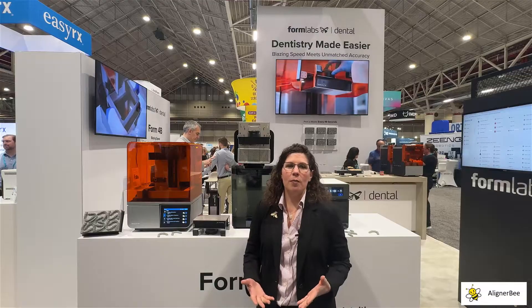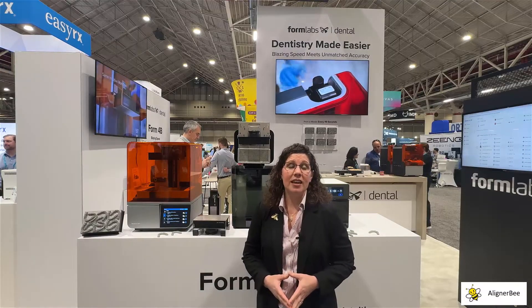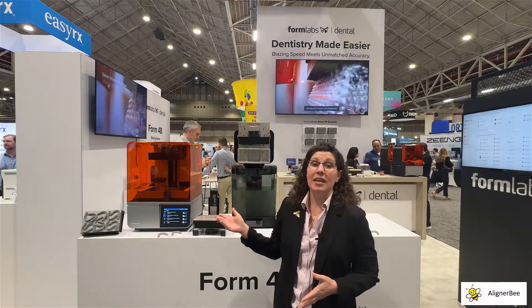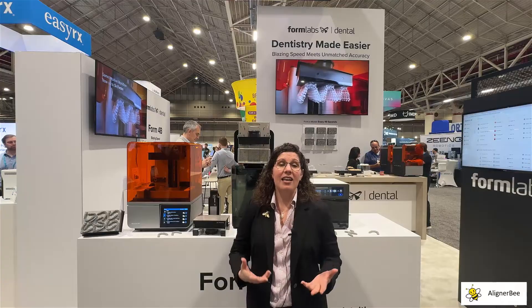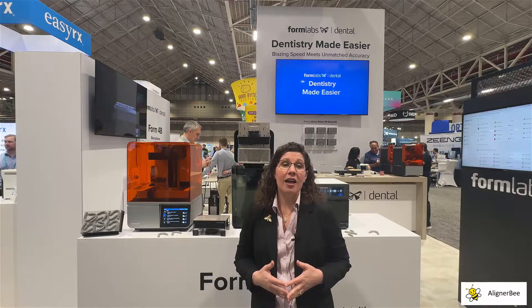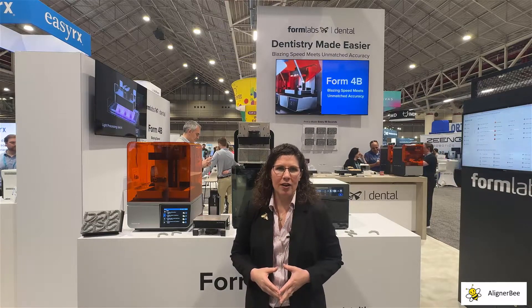Most of us know Formlabs from using stereolithography style printing. They have just released the new Form 4B, which is now a mask SLA technology that can greatly reduce our print times when we're printing with our assistant-driven workflows in the orthodontic space.